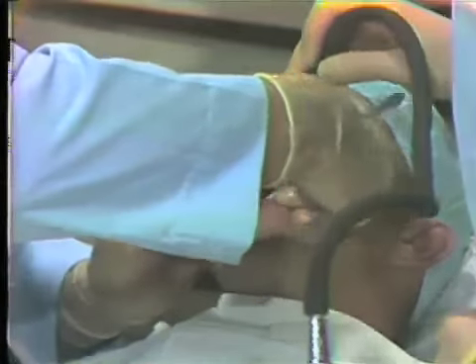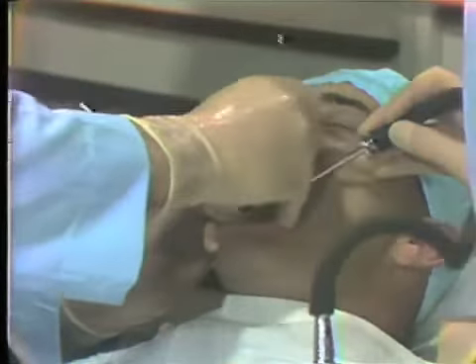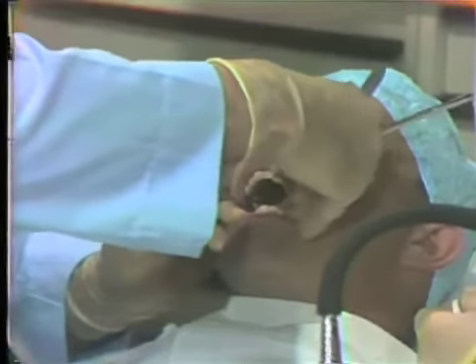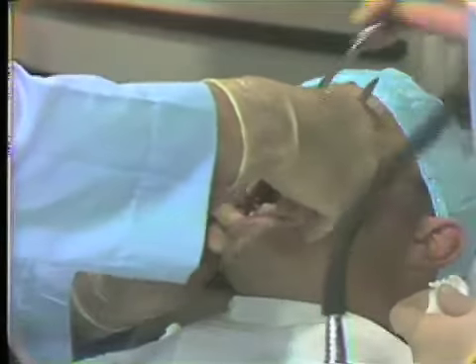Making the incision around the cervical area of the teeth on the lingual aspect of the teeth so that we have some access to the lingual areas also. The periodontal problem primarily is involvement in the interproximal areas. We need to acquire the best access we can then into the interproximal areas.